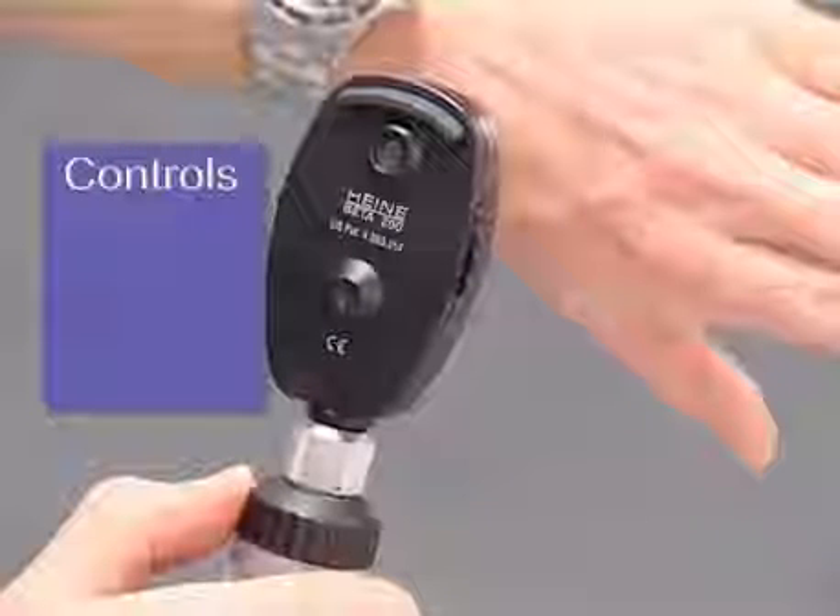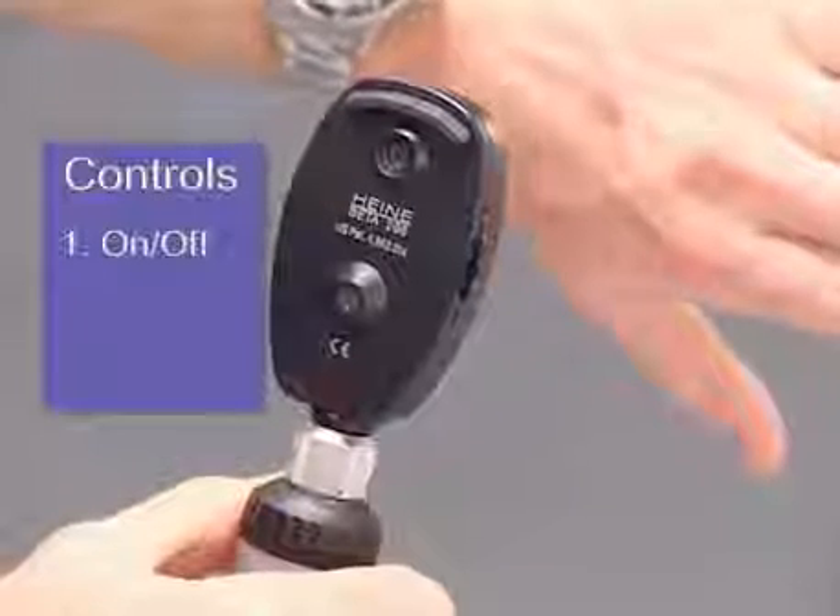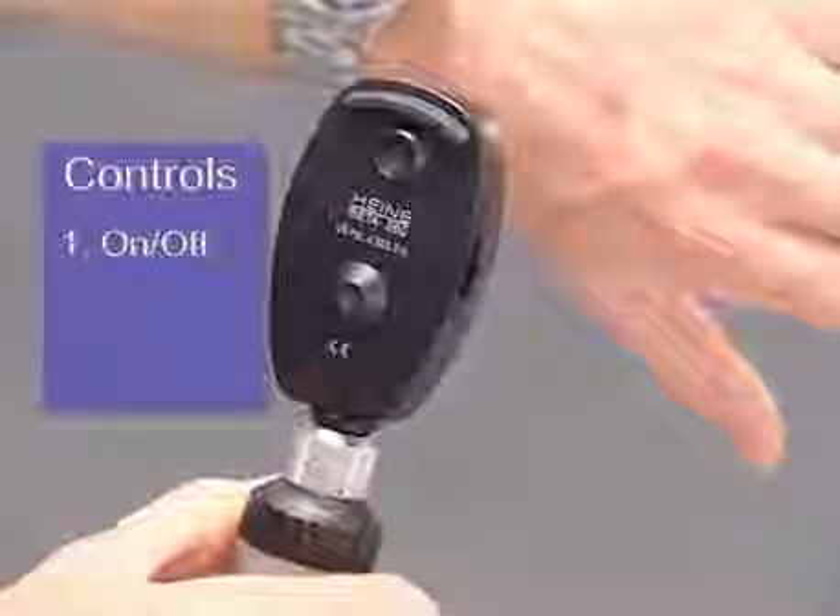There are three basic controls that are common to all modern ophthalmoscopes, regardless of their design. Firstly, there's an on/off switch, which also controls the brightness of the light and is usually found on the top of the handle.